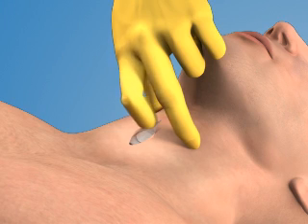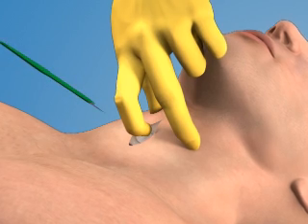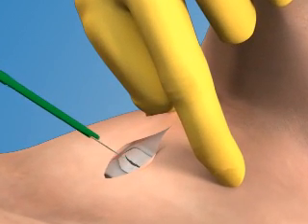Use the index finger of your non-dominant hand to palpate the membrane through the incision. Once the membrane has been located, make a stabbing horizontal incision through the lower portion of the cricothyroid membrane.